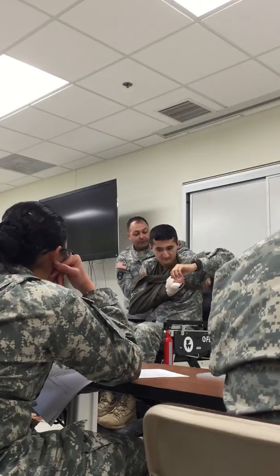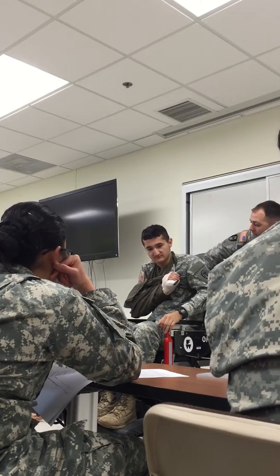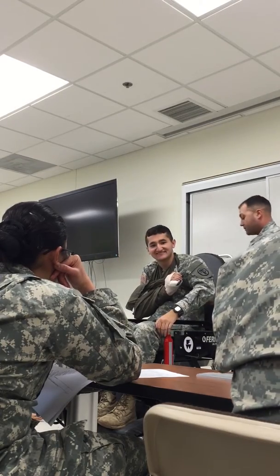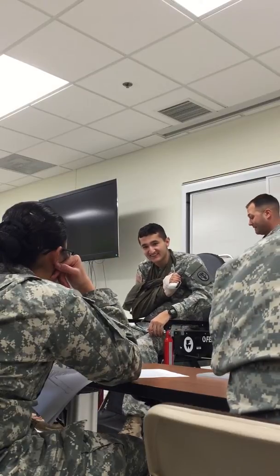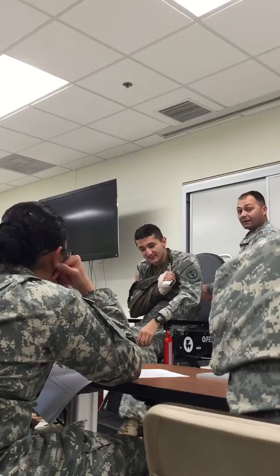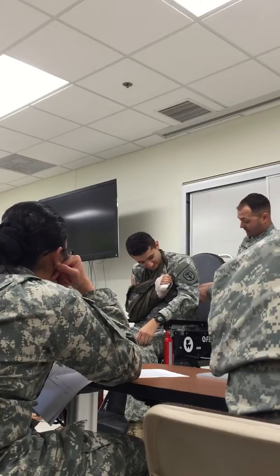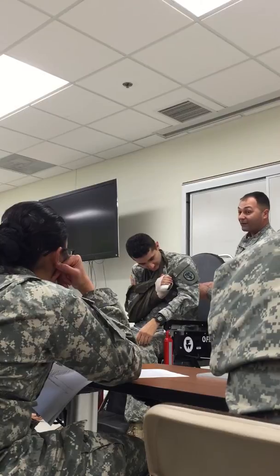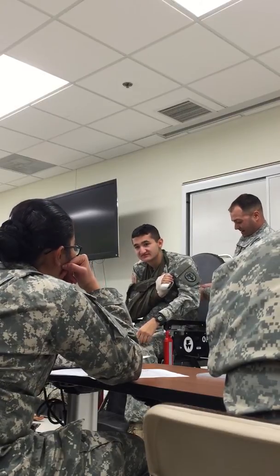Good. This one will fit. So you see, it fits, but you don't. He's skinny. You see the type of person that this fits on, and this barely fits. The best thing to do, if you have questions, is just tie it twice before you even start. Because I can tell you right now that this is using the very tips of the cravat. He's skinny. There we go, non-slip knot.